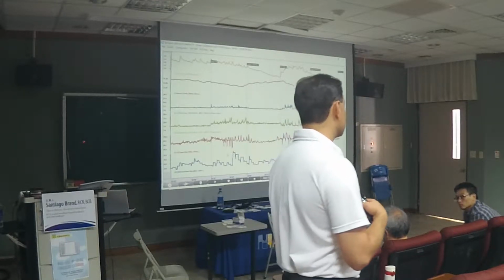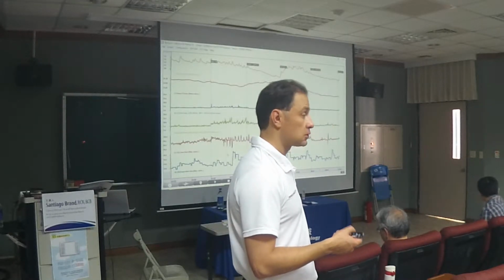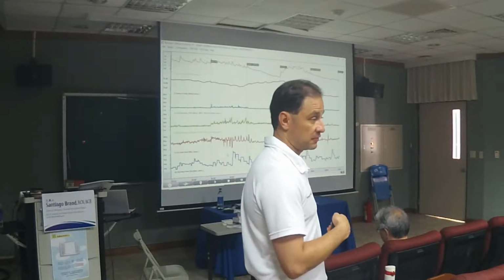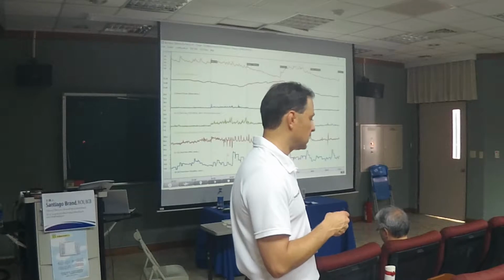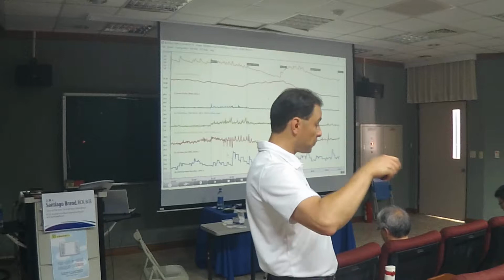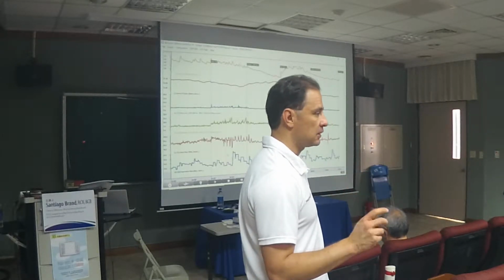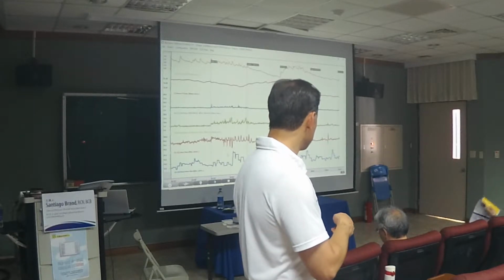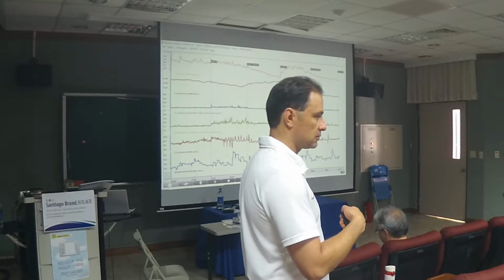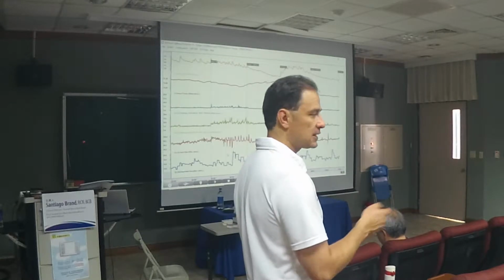However, for a lot of people, it's very unrealistic to get to 2 to 3. It's very low. So my personal opinion, and this is anecdotal, is 5. So I go to a value of 5, and a value of 5 is good enough. Now, if people go below 5 microvolts, excellent. But 5 is an acceptable value, okay? So that's for any EMG group. Shoulders, neck, the legs, the head, masseters, frontalis, any muscle group.